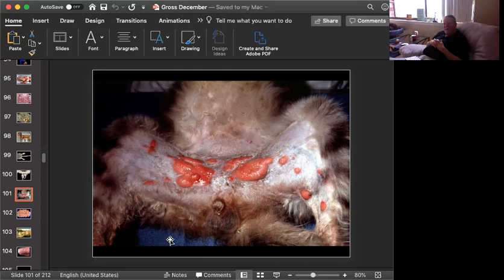So when you biopsy these, you're always going to see a lot of eosinophils. So it makes for a pretty easy biopsy. You don't have a whole lot of differentials. And this is pretty much what they look like. They do respond, in my experience as a veterinarian, to some dietary manipulation, a little bit of corticosteroids in the very initial phase. And this is something the animal's probably going to have on and off the rest of its life. But great picture of an eosinophilic granuloma.